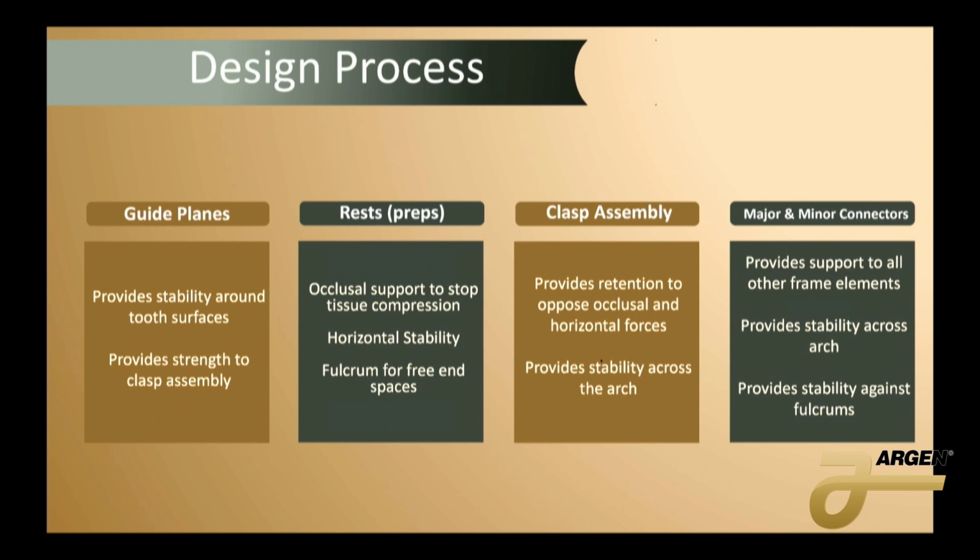If you're going fully digital, what I like to do before I design a case is actually take a snapshot, like a screenshot, bring it into Paint, and just start drawing on it. And then while I'm drawing my splines, I can remember, oh yeah, I need this here, I need this there, and I'm not trying to think of it as I go. I'm designing it before I actually start designing it.